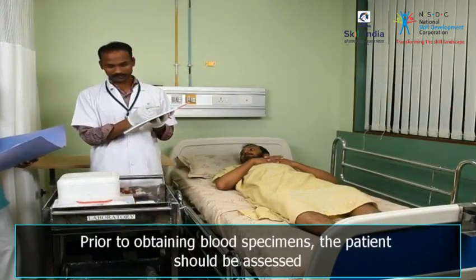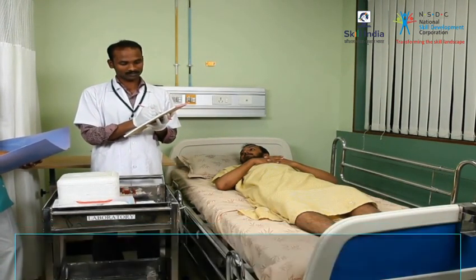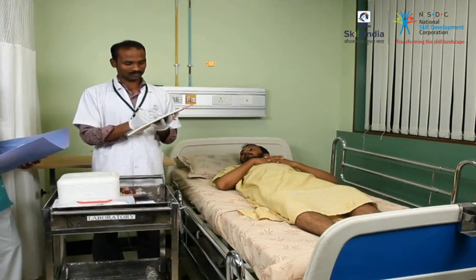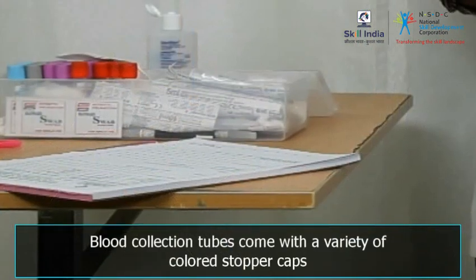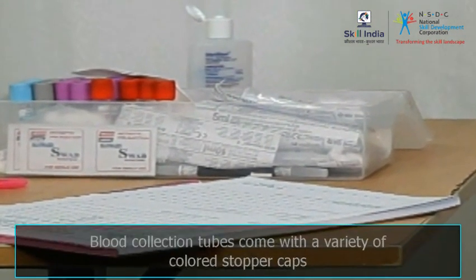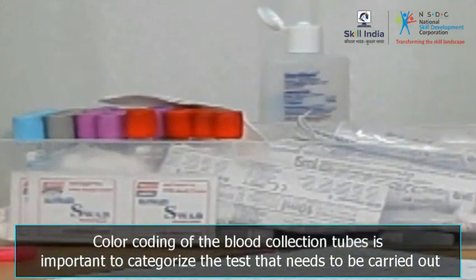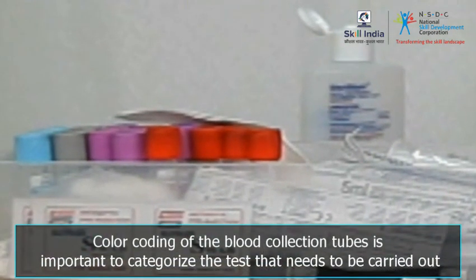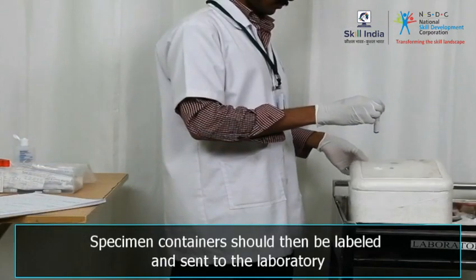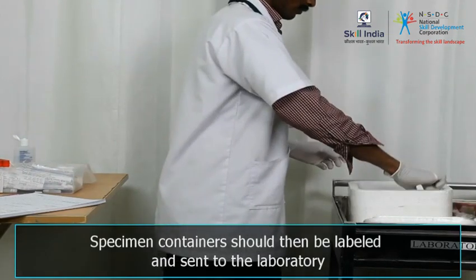Prior to obtaining blood specimens, the nurse should assess the patient, noting factors that may affect test results, including medications, pregnancy, age, and sex. Blood collection tubes come with a variety of colored stopper caps and may contain additives. This color coding of the blood collection tubes is important to categorize the test that needs to be carried out. The specimen containers should then be labeled and sent to the laboratory.